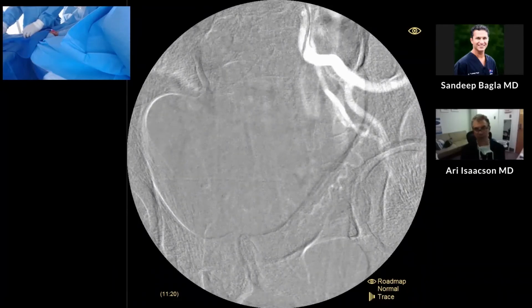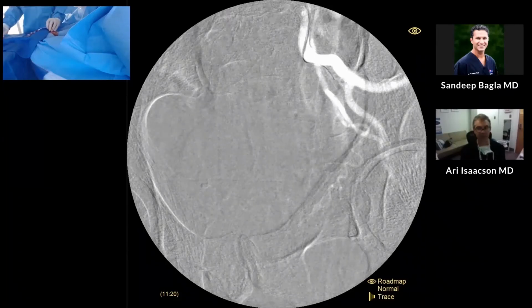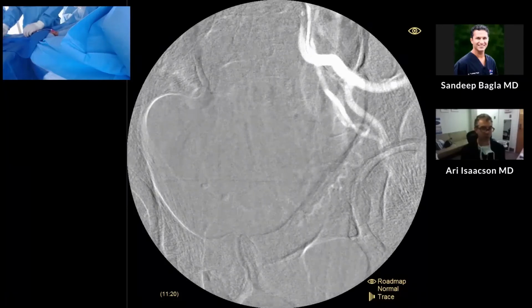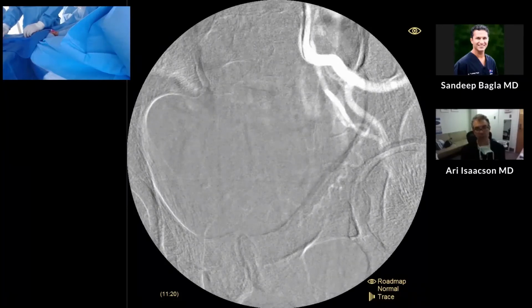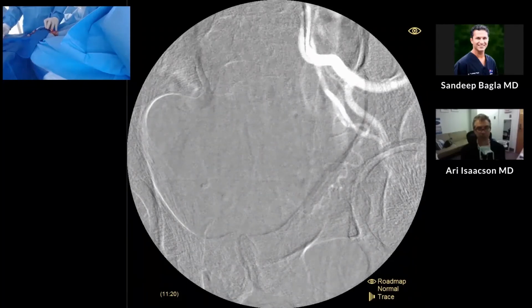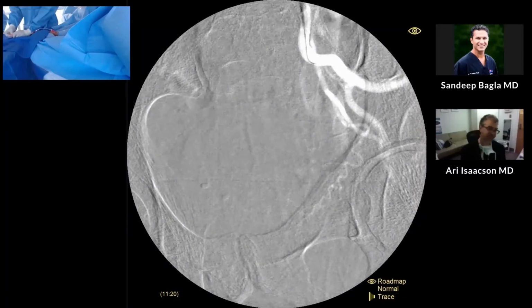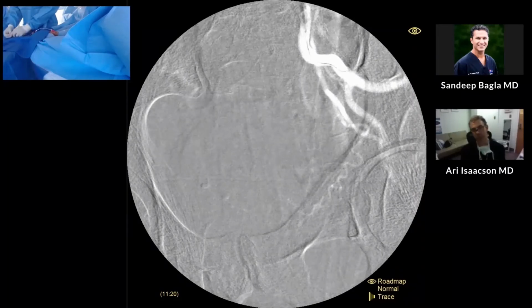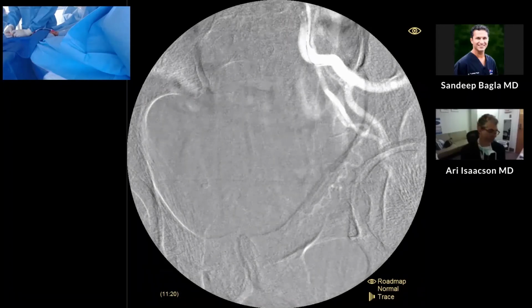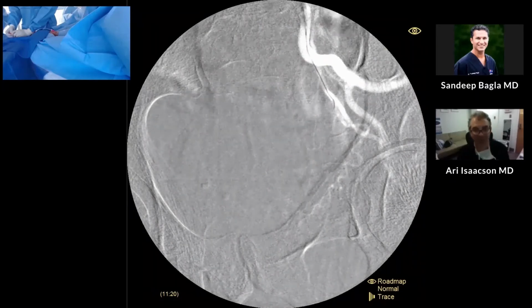When I first described that, I said it's about 6 feet, and now I'm with you, I'm about 5'10". We kept getting more and more limited with our current catheter lengths. So now with the 175 centimeter, it really expands whom we can perform radial PAE for. You've used this catheter already, I assume, right? I have, on a Thursday. The first person on a Thursday to ever use this catheter.